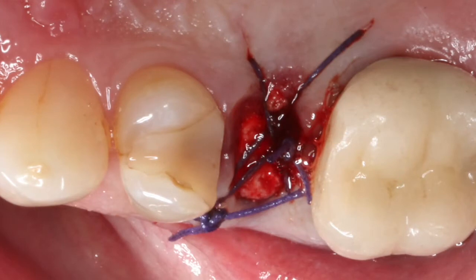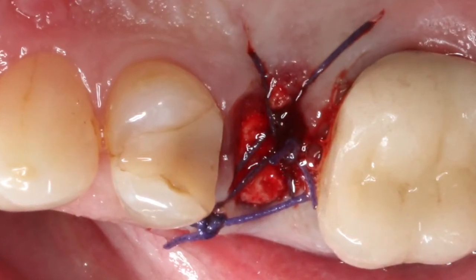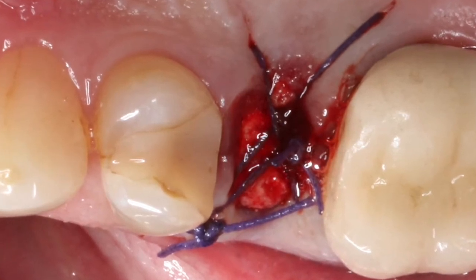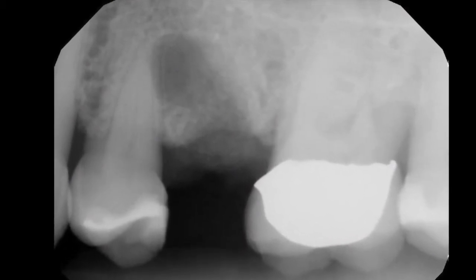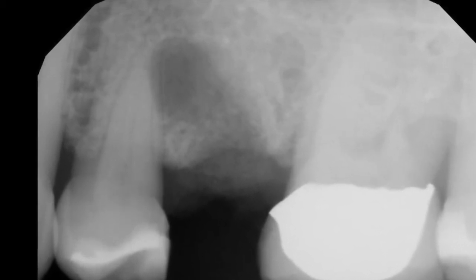The area will then be sutured closed. I have just two cross-linked Vicryl sutures, and you can see immediately postoperatively what this material looks like. You can see that there is a little bit of radio opacity, not so much at the apical portion.